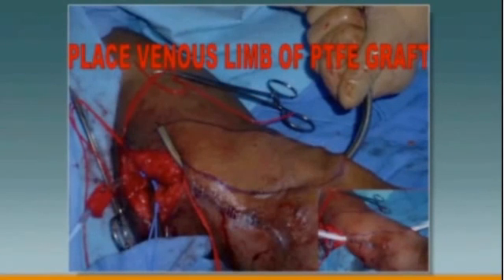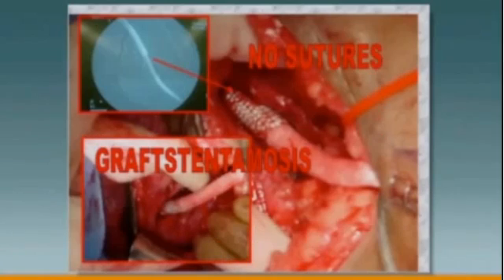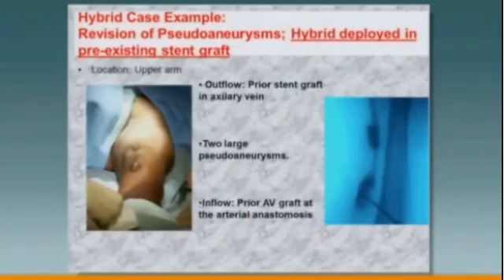We're a little bit concerned about this particular patient getting an ischemic hand. So this is an upper arm loop graft that we're putting in with a combination of stent graft. When the stent graft is deployed, it's in the adequate outflow vein. And down here where the 6-French introducer was initially, a little bit beyond this — 3 to 4 centimeters — is a sutureless anastomosis. The intermediary part has to be angioplasted to completely deploy the stent graft. Here's your sutureless anastomosis: you can see graft, stent graft, in-graft, stent graft. It does not leak.